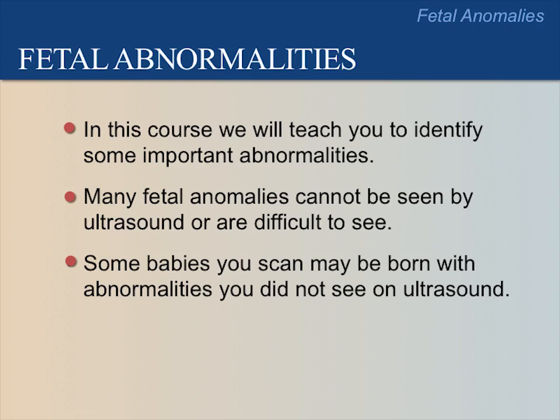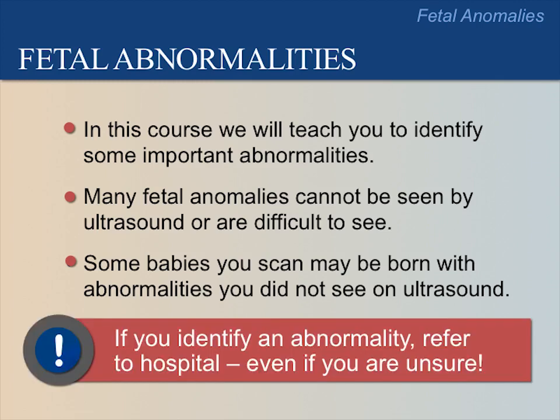We are also not able to teach you in this course how to identify all fetal abnormalities. If you identify a fetal abnormality, always refer to the hospital, even if you are unsure. It is more important to make the right referral than the right diagnosis.